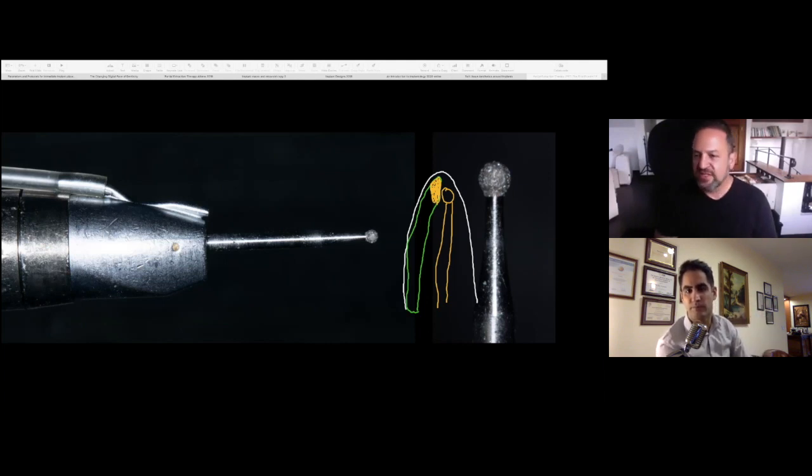Yeah, my kit does not have this drill. It has a different drill I call the Richard Martin drill. We all know Richard Martin is a brilliant maxillofacial surgeon from Dallas, and also part of our research team. It's a different drill which has the markings, which allows you to do the same thing as this. But I wanted to show this in the technique, because a lot of people don't have that kit, and you want to be able to use things that are generic to your practice, things that you have, so that everybody has the opportunity. It's not that you have to buy the kit. Do I want you to? Of course I want you to. But do you have to? The answer is no. You don't have to, and that's why we've done it that way.